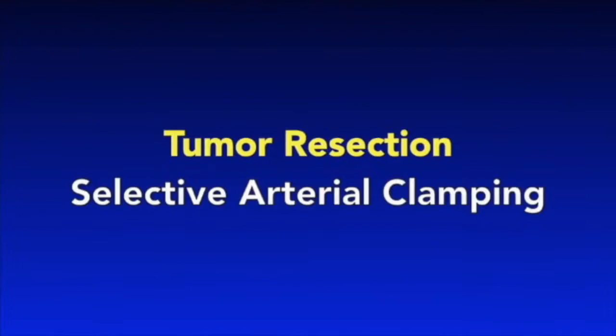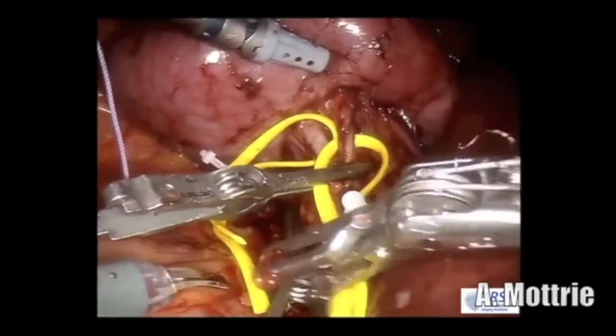Dr. Mottrie will demonstrate the technique of selective arterial clamping by applying bulldog clamps to isolated branches of the main renal artery. Indocyanine green is administered and the boundary between perfused and ischemic kidney is identified. The tumor is within the ischemic zone. A bulldog clamp is removed from the anterior artery, leaving a branch to the tumor still clamped.